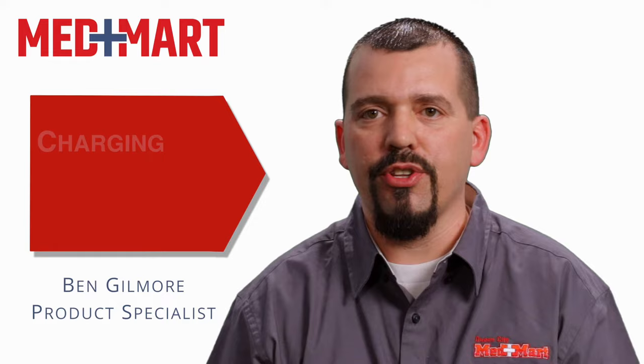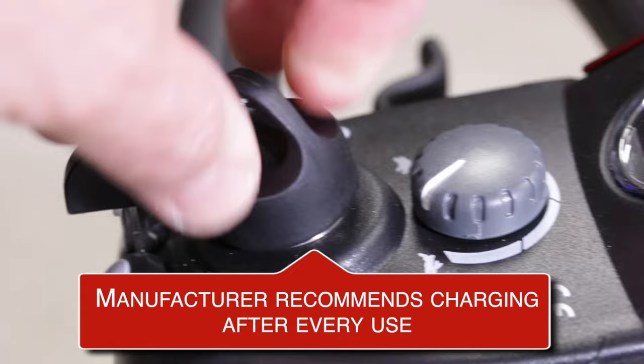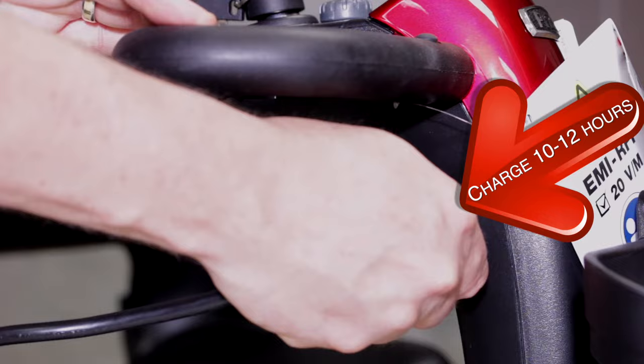Usually the best way to charge your scooter or power chair is to charge the equipment after every use — that's the manufacturer's specifications on proper charging methods. What we've found is to use your scooter until you've run it about halfway down. That's a good time to plug it in and charge it for 10 to 12 hours.